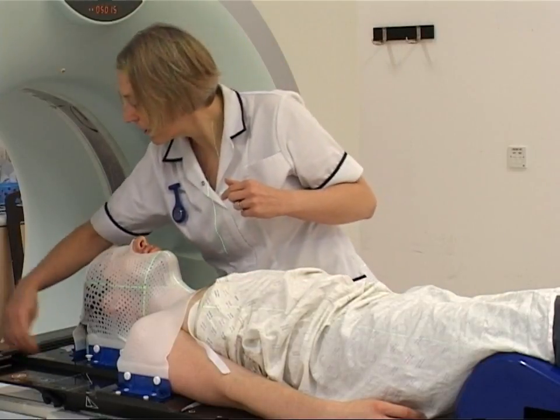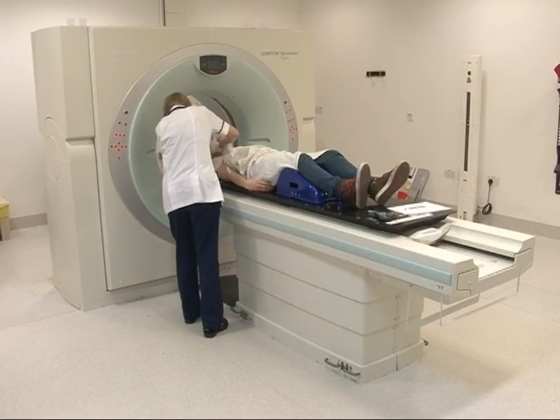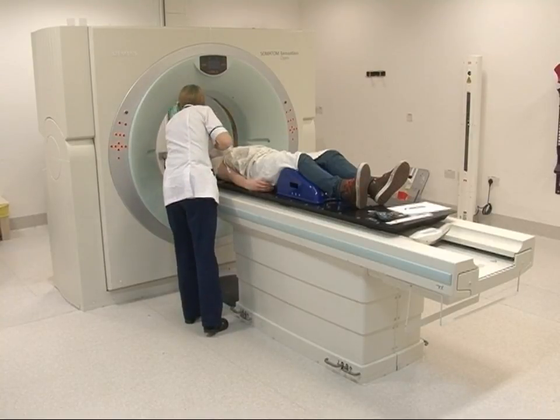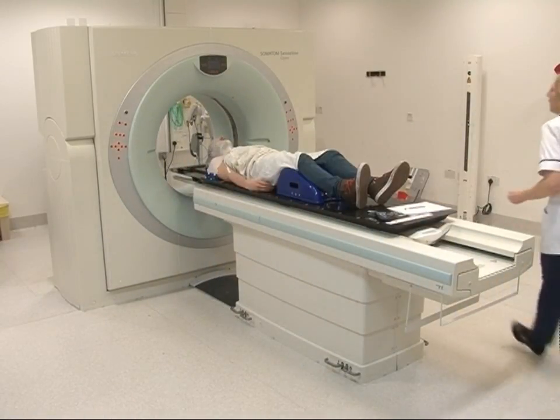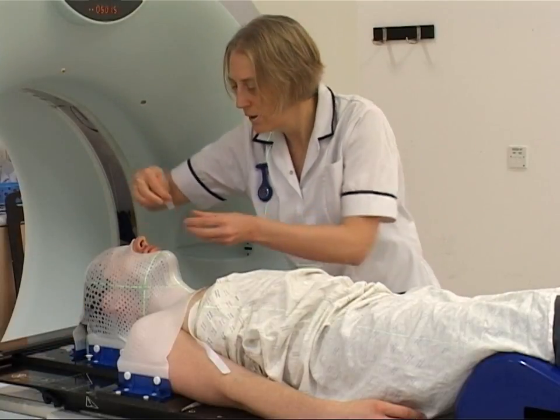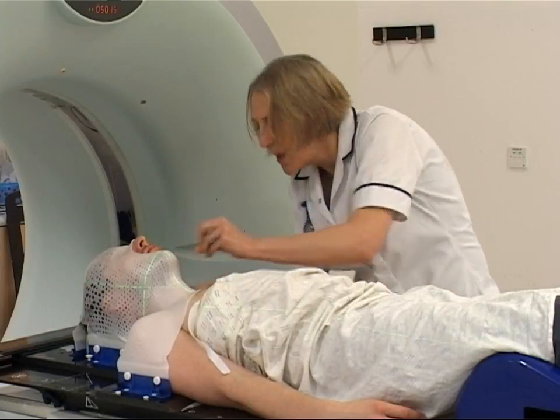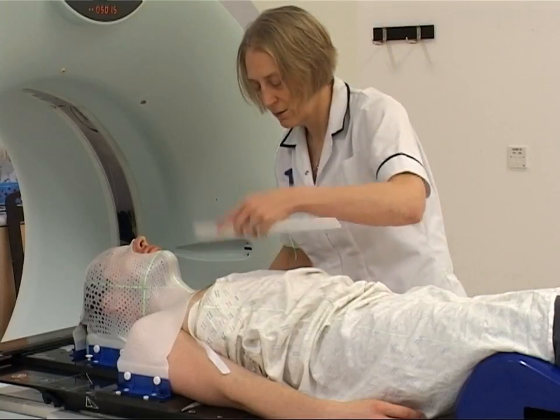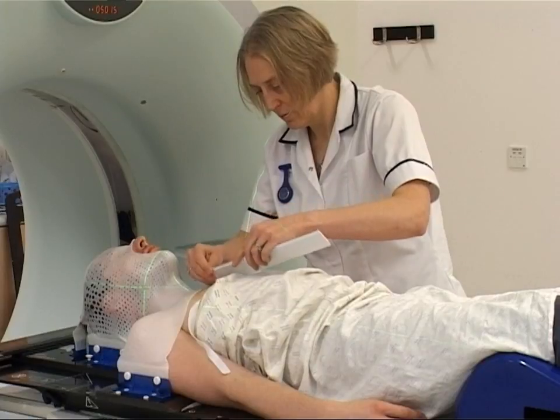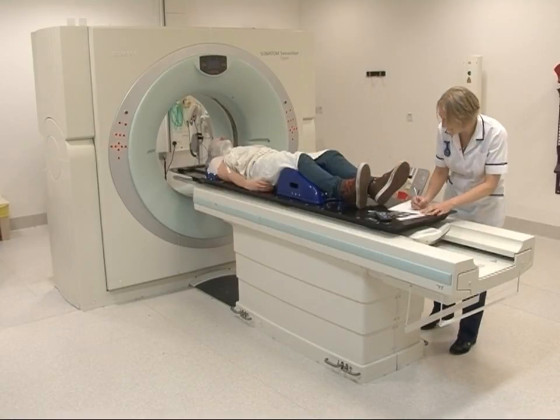The planning scan is a CT scan — you may have had one as part of your diagnostic tests. You will need to wear your radiotherapy mask for your planning scan. Sometimes an injection of a special dye is needed to make the scan easier to read; this will be explained to you beforehand. The planning scan takes about 10 to 15 minutes. Most of this time the radiographers will be in the room with you, positioning you for the scan, taking measurements, and making a careful record of your position for the treatment radiographers to follow.